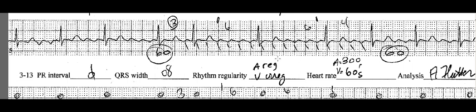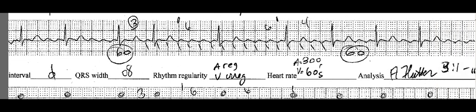Your atrial rate looks like there are five little boxes between flutter waves, so that would be an atrial rate of 300. I did two six-second strips and got 60 — six times ten on each end — so the ventricular rate is in the 60s and the atrial rate is in the 300s. The atrial rate is very consistent, as proven by my markings. The ventricular rate was irregular. For QRS width, pick any of these three where you can clearly see the R wave and S wave. This would be atrial flutter with a three-to-one to six-to-one ratio.